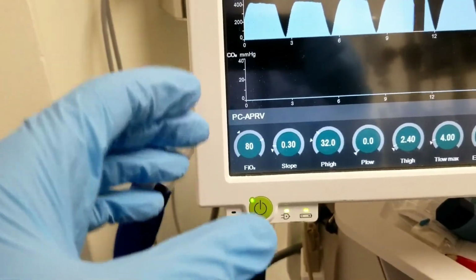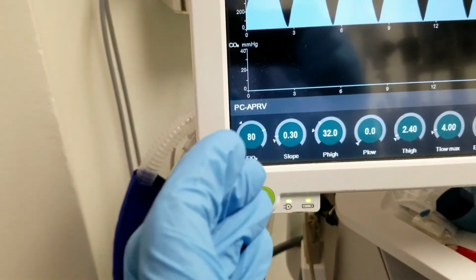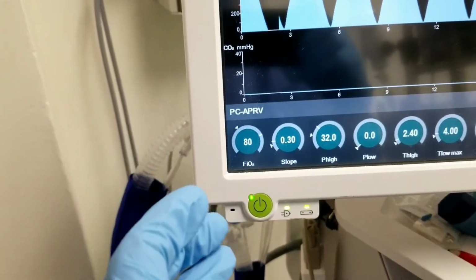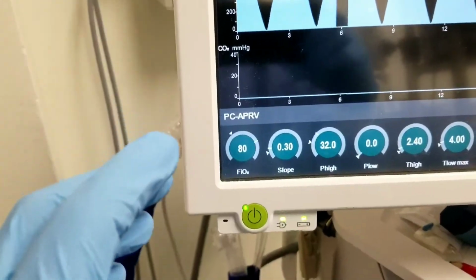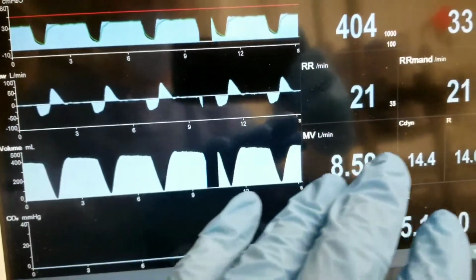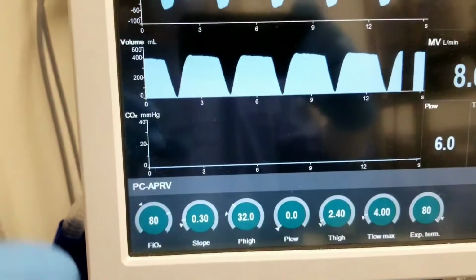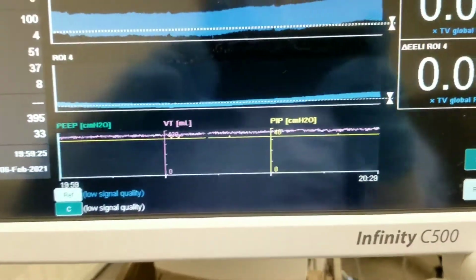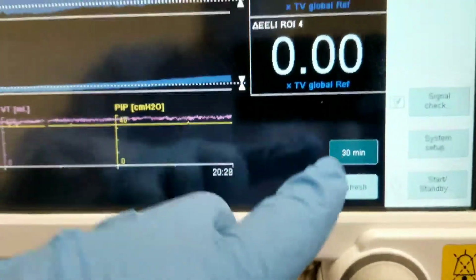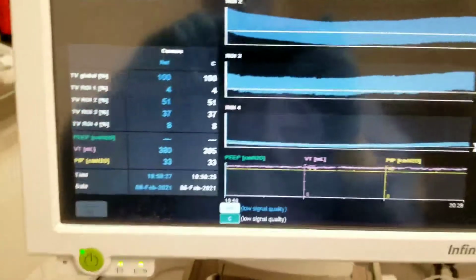Now we are looking inside the lung through the electrical impedance tomography technology, and we're actually able to see where the air is going. We usually do global mechanics here. That doesn't tell you where regional distribution is, and that's what's amazing about Draeger and the Pulmovista. I'm looking a little further back in history.